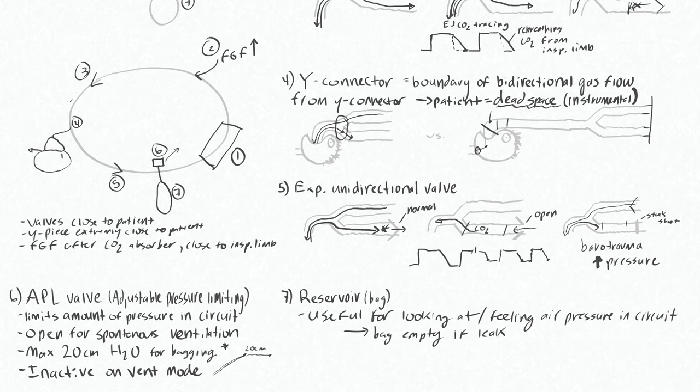And then it makes sense to have your bag and vent by the APL valve. One thing that's probably tempting is to draw this bag or reservoir right before the patient, because you like to think that you're squeezing air directly into the patient. But in reality, what you're doing is you are squeezing this bag and creating pressure that's sent through this entire system onto the patient. So with those things in mind, you should be able to recreate this drawing pretty easily.